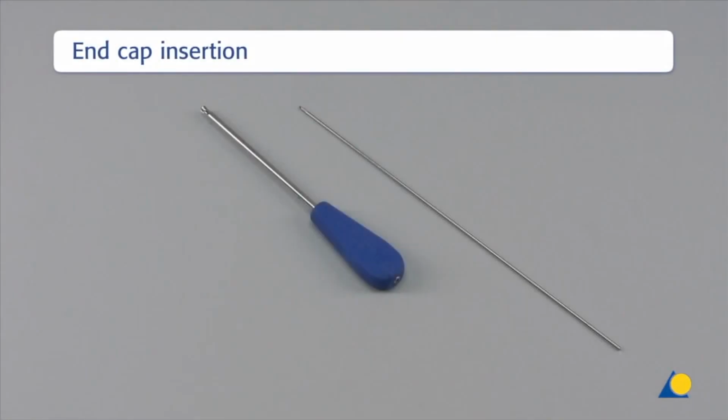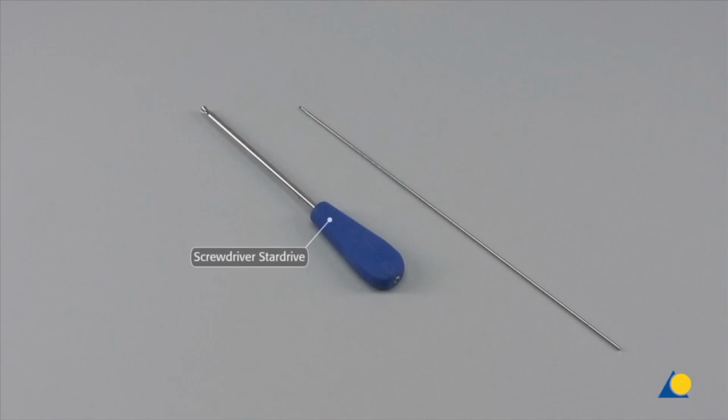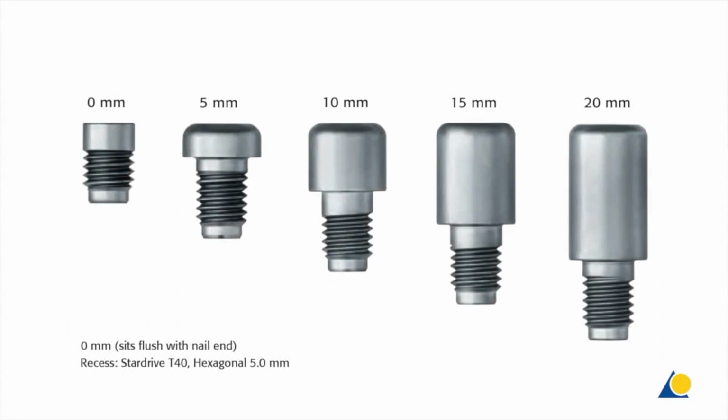The instruments for end cap insertion are the screwdriver star drive T40 with spherical head, cannulated, length 280 mm, and the guide wire. When bony ingrowth into the proximal end of the nail is of concern, the use of an end cap is recommended. End caps range from 0 to 20 mm in length in 5 mm increments.